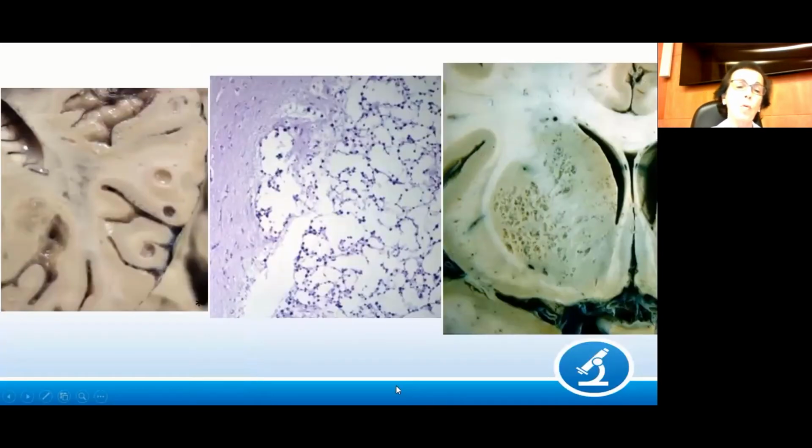What I'm going to show you now is that not all parenchymal lesions by cryptococci are cryptococcomas. In fact, these are extensions of the meningitis. Here's the meningitis full of cryptococci, and they follow the vessel walls, the Virchow-Robin space, and they go towards the brain, and they can cause these cystic areas.